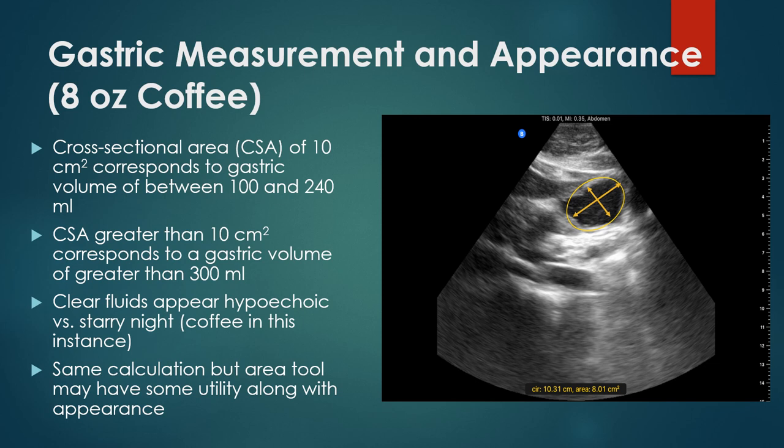Again, clear fluids appear hypoechoic, and you can use the area tool on your handheld. I wouldn't recommend it. It wouldn't work very well in a court of law. Dr. Perlis would probably come up and testify against you.